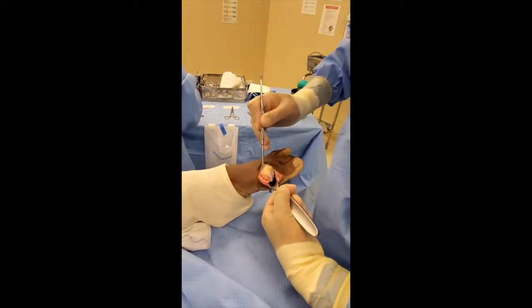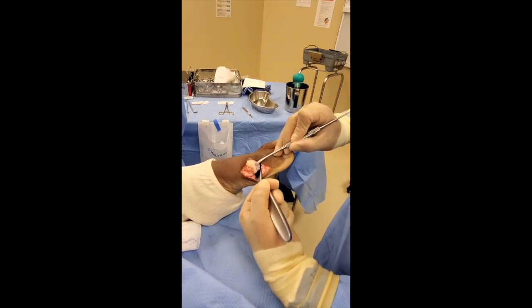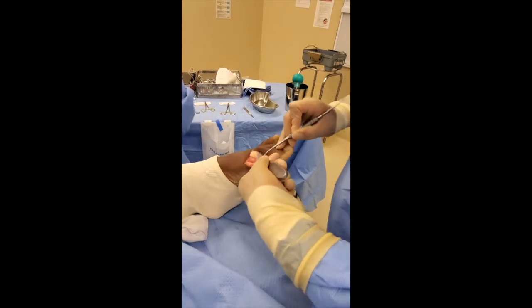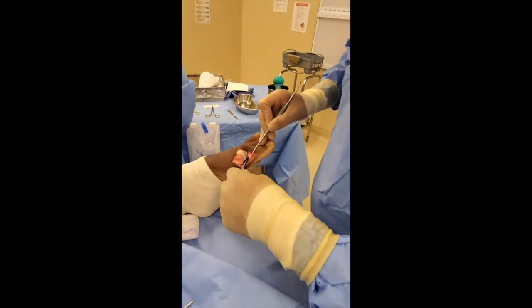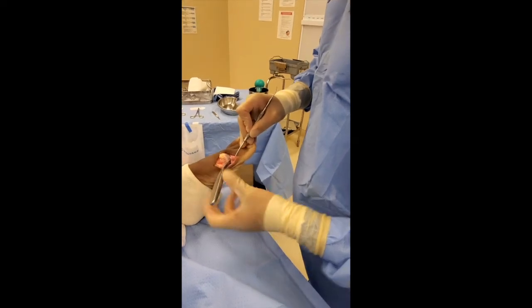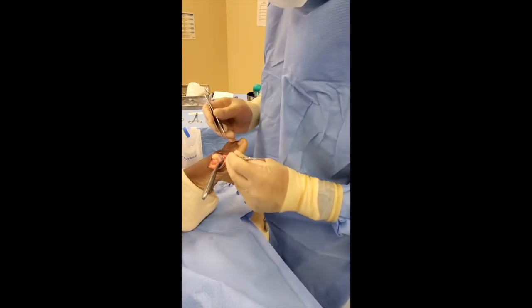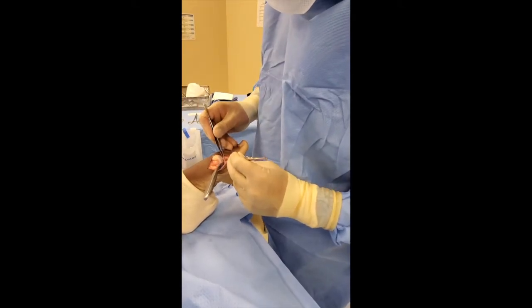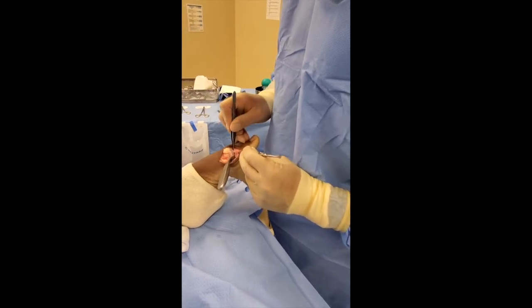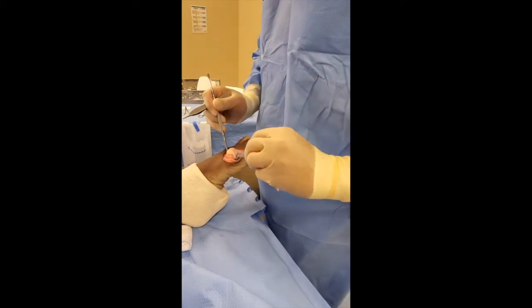All of this bone above this instrument is abnormal, all the way around, as well as the growth on the opposite side of the joint. We have a loose fragment here — as the bone grows it becomes weak and cracks off. See this piece right here, look how loose it is. That's a fractured piece of bone on this side of the joint. We have a lot of work to do.